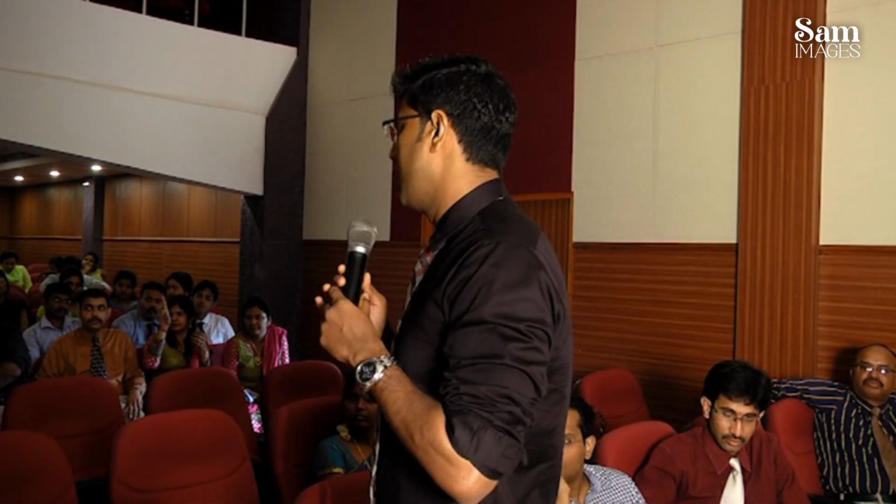In head and neck applications, a few other things that might be of relevance to you, which we have not taken today because it's a little bit of a primer, are your power Doppler and your contrast enhanced ultrasound. Both of them hold a lot of promise in head and neck lesions. Which I'll maybe talk about in the next CME if Madam is kind enough to arrange one more.